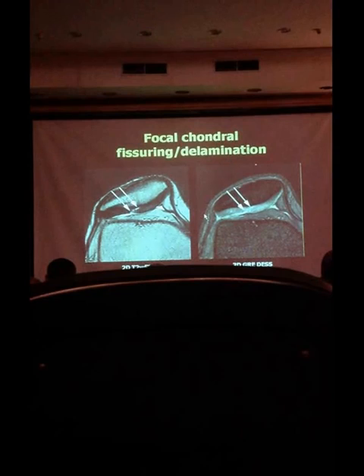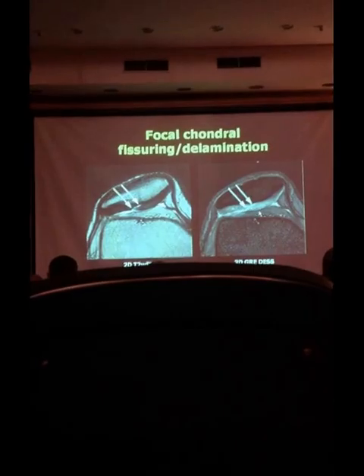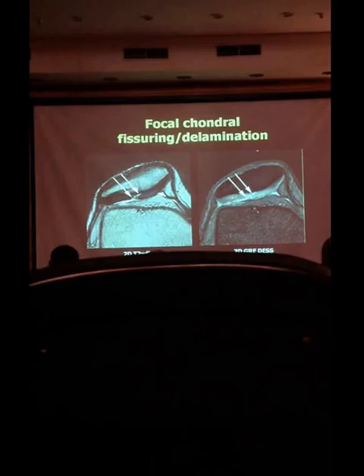You can see here maybe we have some problem going on in cartilage, where the arrows are pointing out in this sequence. But we don't have enough contrast between synovial fluid and the articular cartilage. And it's a problem. We still have on such sequences some magnetic susceptibility artifacts that are giving us some trouble, some problems to detect this focal point.